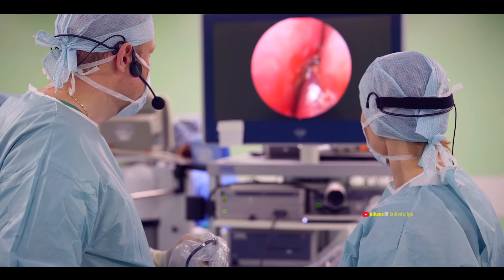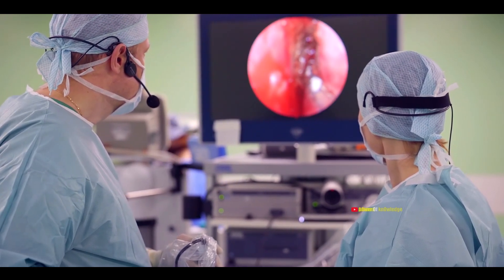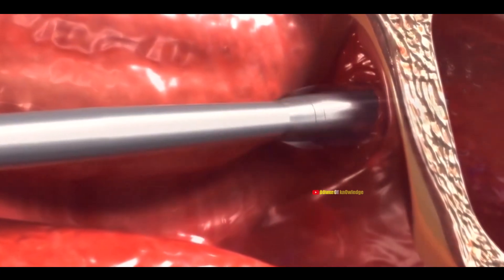In balloon sinuplasty, an endoscope examines the closed sinus using your nasal passage. Then, a tube with a balloon at its tip is inserted into your nose. The tube is guided to the closed sinus, and the balloon is placed in the sinus opening and inflated, opening the sinus.